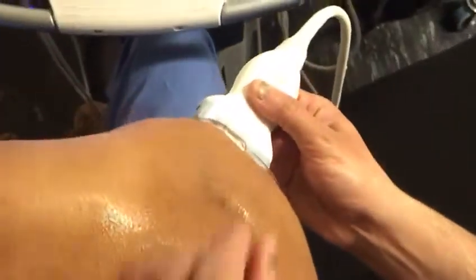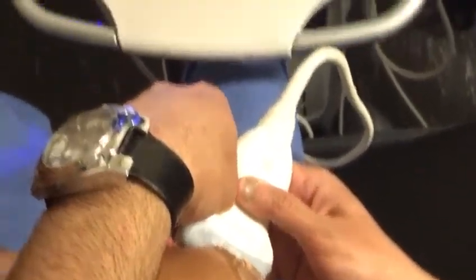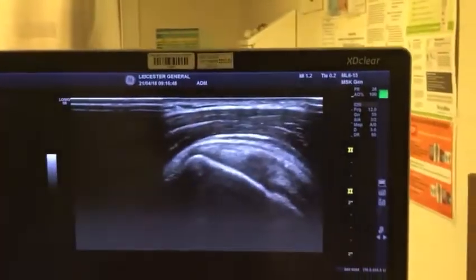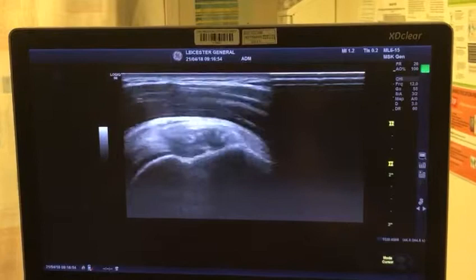Okay, so what you do is put your probe just underneath the acromion. That's the picture you want — distal to proximal. I'm going to show you guys.